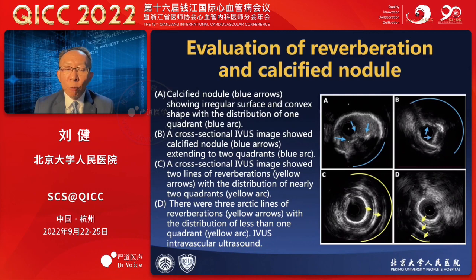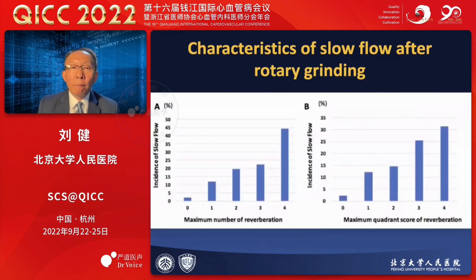the waves, and it will look at the result of the atherectomy, and we think that this is a very important imaging modality.